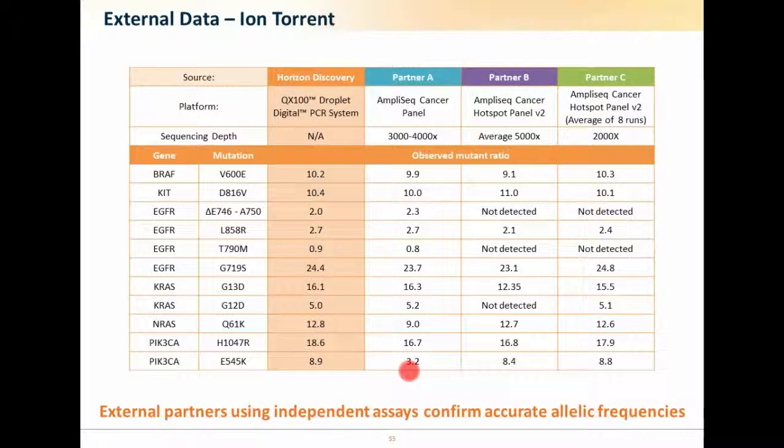The feedback we've got, and what we are looking to do next, is that now that we have this standard, we can really start to understand where there is variability in these assays, and use an external, digital system to show where tweaks or improvements may need to be made to the particular panels to be able to detect these mutations.